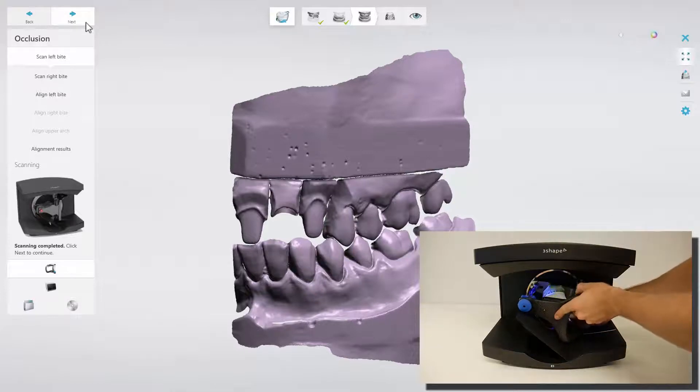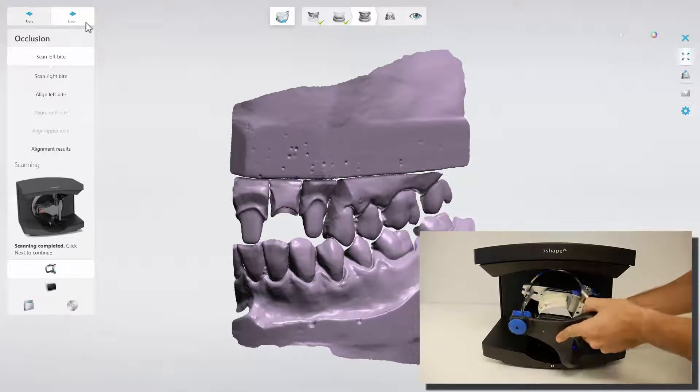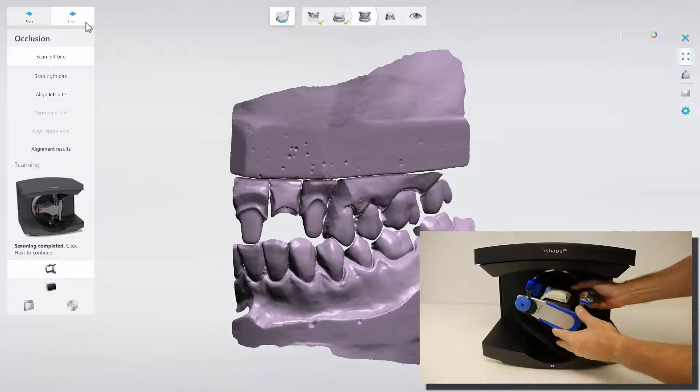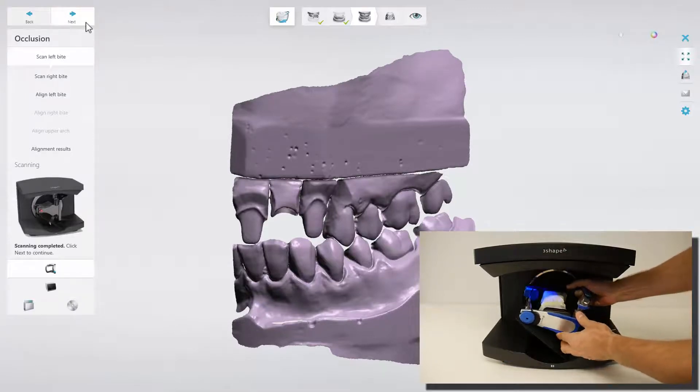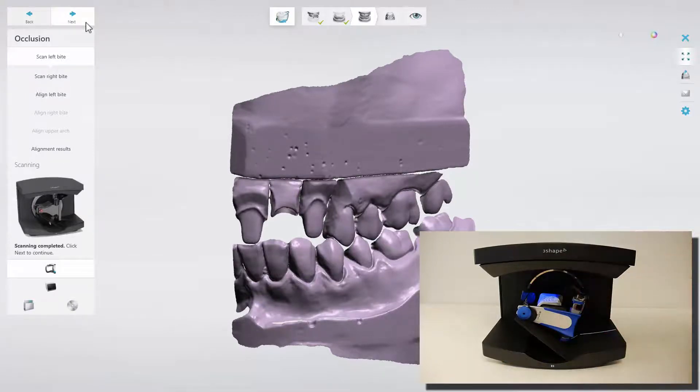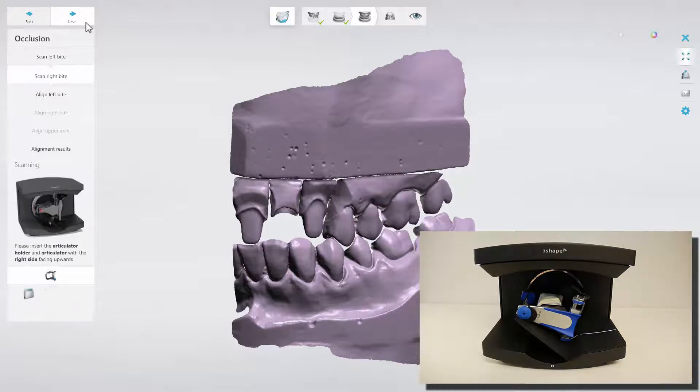Flip the Articulator to the other side and place it into the scanner. When it is ready, click Next.